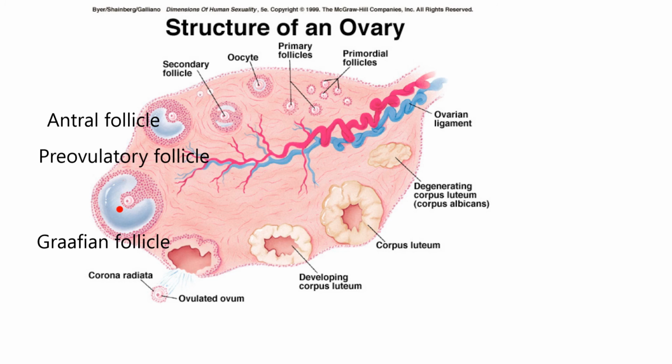It's going to ovulate. That means it's going to release the egg. And actually, see down here? This is happening here. Nothing travels after this point as far as the follicle. It ruptures at ovulation. The egg goes out and gets caught by the oviduct. The fluid leaves. And actually, this cavity fills with blood. But after 2 or 3 days, it organizes into a solid tissue, and that solid tissue is called a corpus luteum.